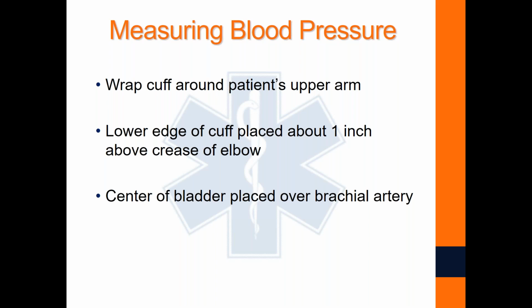As we're inflating that blood pressure cuff, we're going to listen, and we listen and listen, and eventually we will hear Korotkoff sounds. We will hear that pulse, and we pump the blood pressure cuff up until that pulse goes away. And we give it a couple more pumps just to be sure, and we slowly open the valve to let that pressure off, and that air will start leaking out. And then we're listening on the way down, and we're going to listen for when we hear that pulse sound return, when we hear those Korotkoff sounds again, and that's going to give us our systolic number.